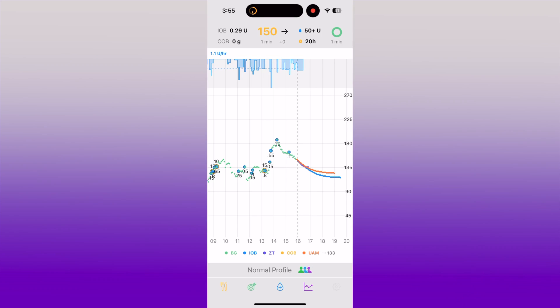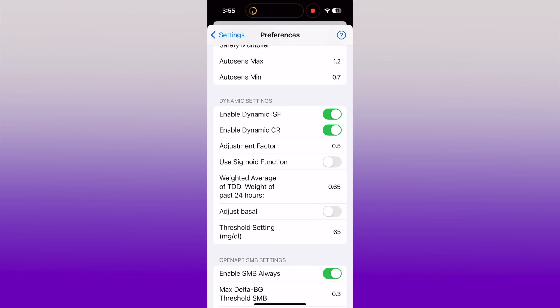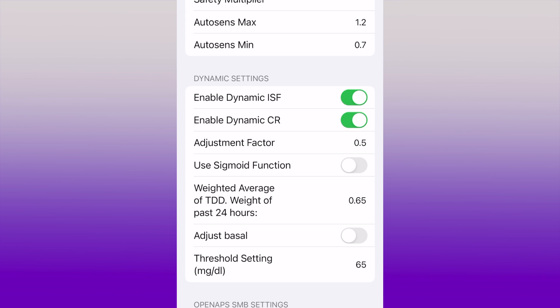Part of what makes IAPS's algorithm so powerful are its dynamic settings. There are a few settings that will change every five minutes based off of the last two weeks of data and the last 24 hours. This is the ISF — the insulin sensitivity factor — that is dynamic. The carb ratio is dynamic. I have seen the dynamic settings get stronger and stronger, because on the first day it doesn't have two weeks of data to pull from, it has less than a day's worth of information. The algorithm got stronger over time as I updated settings as well.